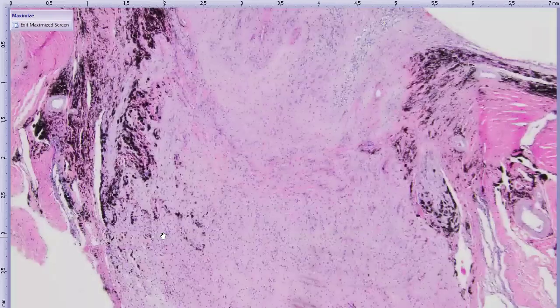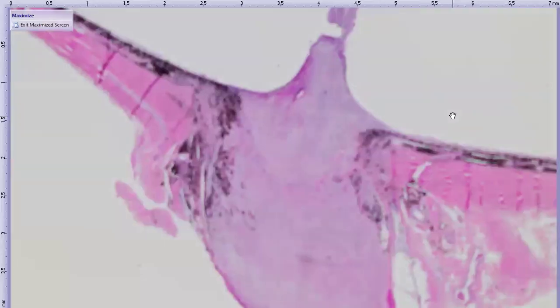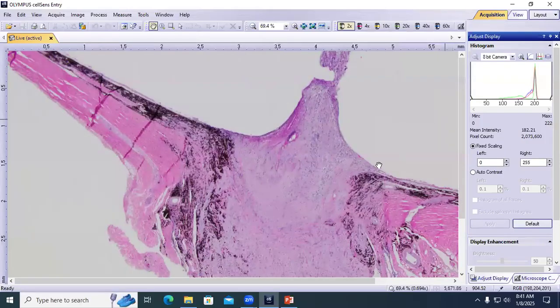So the lamina cribrosa, I'll go back to lower mag, should be at the same level as the choroid. So the choroid is up here. So this lamina cribrosa here should be all the way up here. So this is quite an atrophied optic nerve. So those are the main features of this case. I thought it was just a very nice illustrative case of PHPV, or at least persistent fetal vasculature.